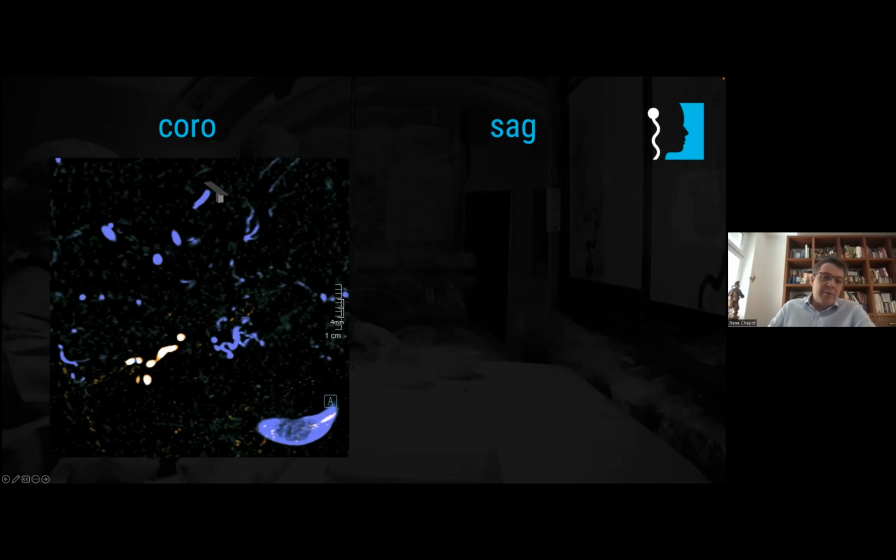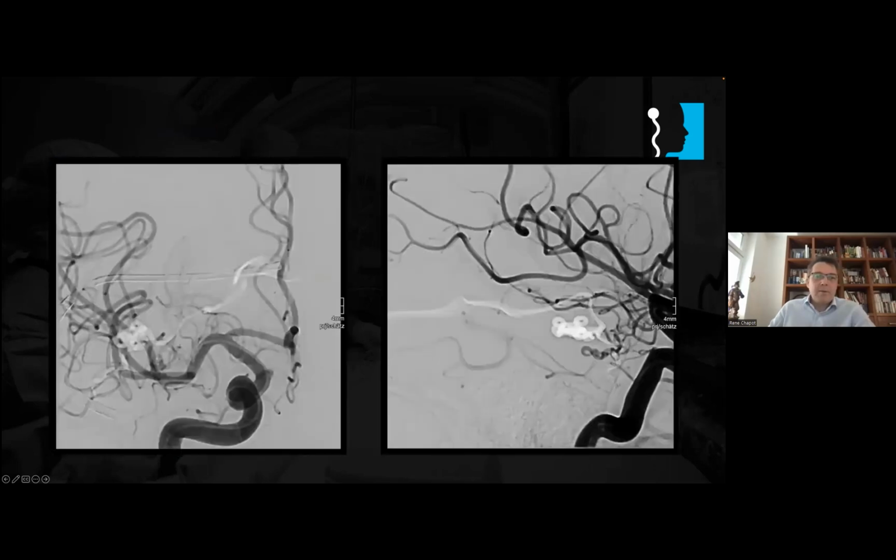So already this is an important info, because it means that if you are in this feeder, if you occlude the vein, you may have this here, which is still coming, which may rupture the AVM. So where is the other feeder? Of course, there are other ways to do it. Everything can be done by different techniques. And here is where our microcatheter is, and here is the other part. Maybe it's easier on the lateral view. The main part with the easy feeder, and the second feeder, which is here, where the access is more challenging.